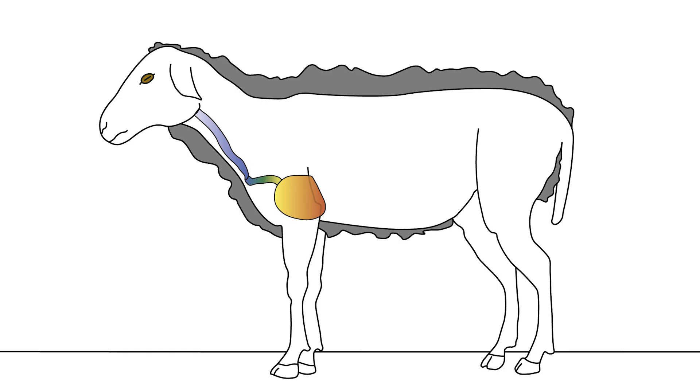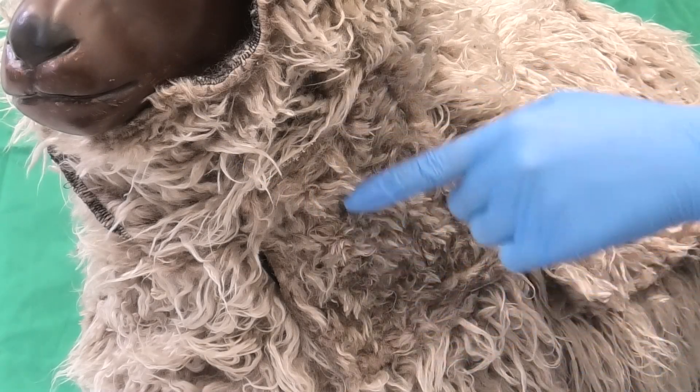Sampling blood from sheep can be done either from the vena jugularis externa or from the vena cava cranialis. In this video, the vena jugularis method will be demonstrated.